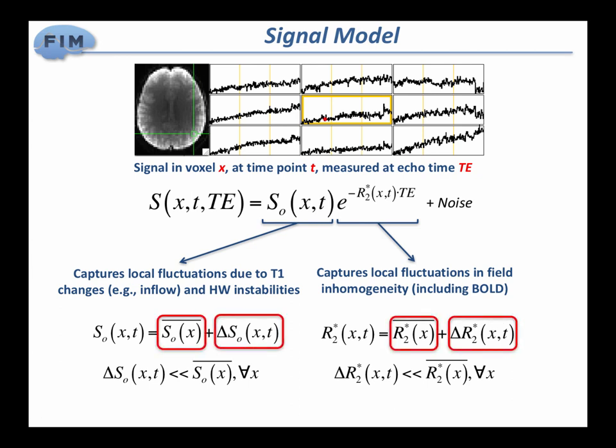And now that we have multi-echo data, we might want to try to separate these contributions. Before, when you just had one echo only, it was hard or sometimes impossible to separate them. Because we have multi-echo data, I'm going to show you that we can do things to actually start separating and getting estimates of each of those things separately.